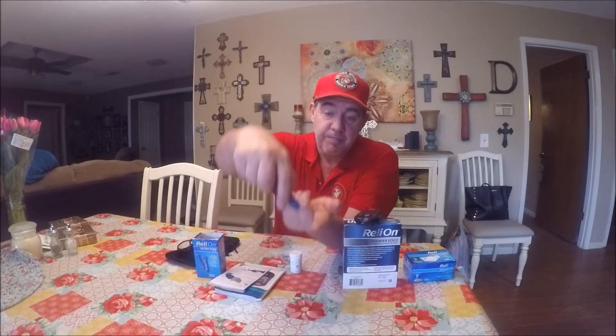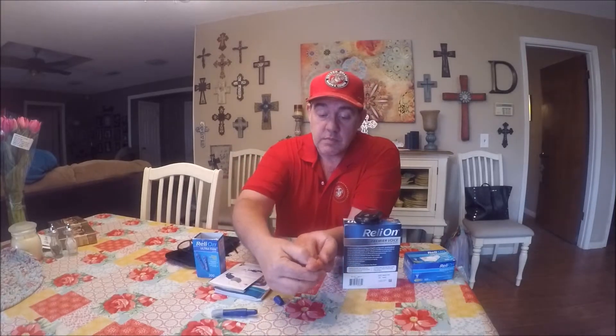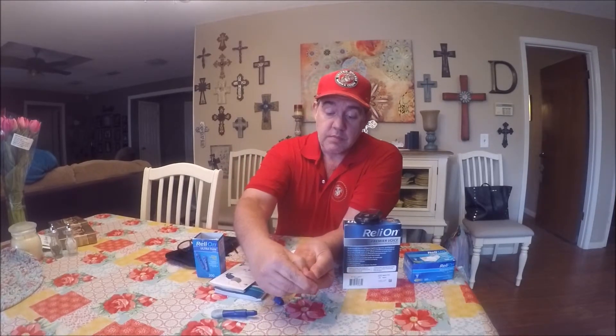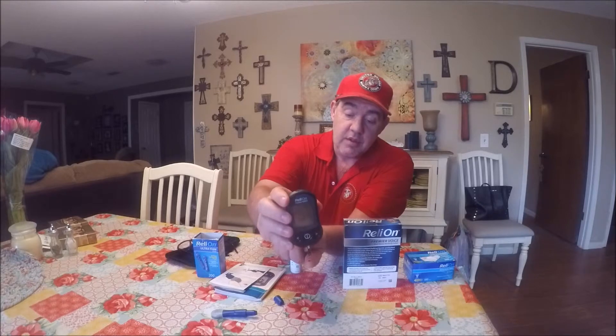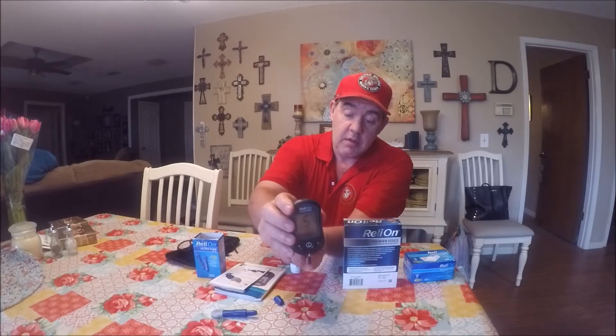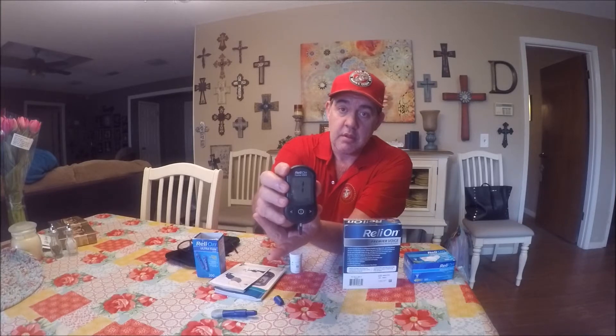I'm gonna punch my finger. All right, as you can see there's a little bit of blood, and all you do is just touch the end of the stick to the blood. Your blood glucose reading is 110 milligrams per deciliter. And it tells you exactly what it is.